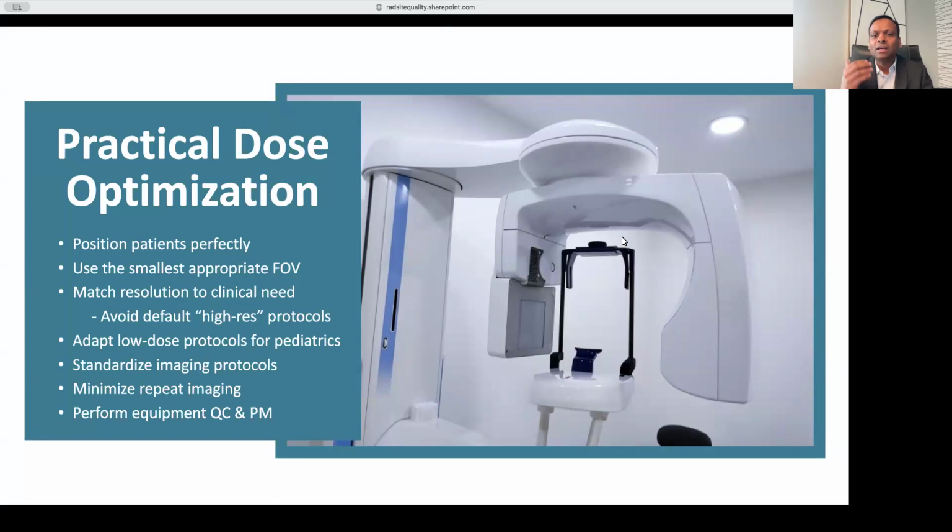Yeah, I've done that. So from that standpoint, I would think we should go with the basic definition of optimization, which is to minimize dose without compromising on image quality, pretty much maintaining image quality. So that should be the first and foremost thing that we should have in mind before we take a deep dive into optimization. So sorry, Chris, I'll let you go through that, and then I can take any follow-up questions on that.